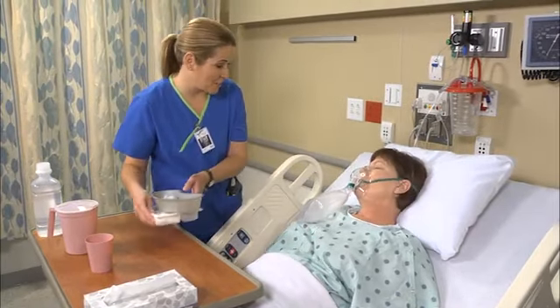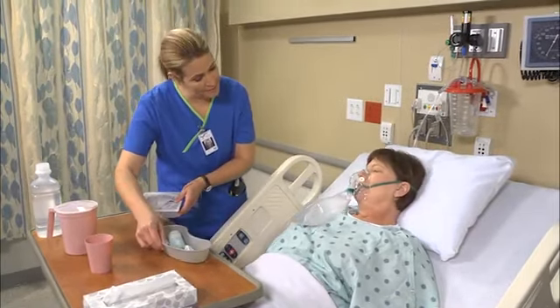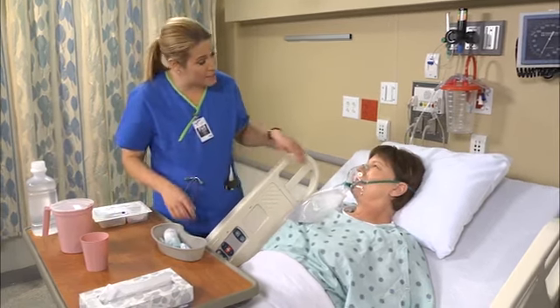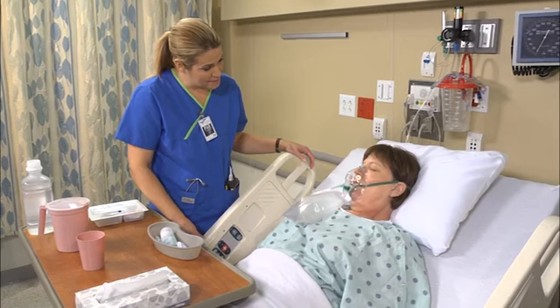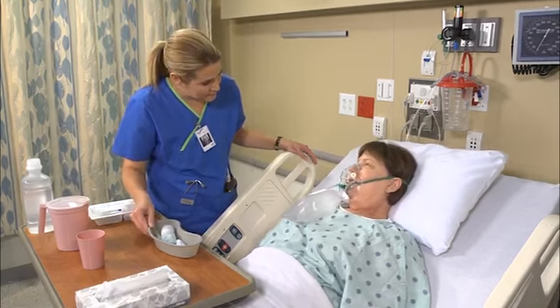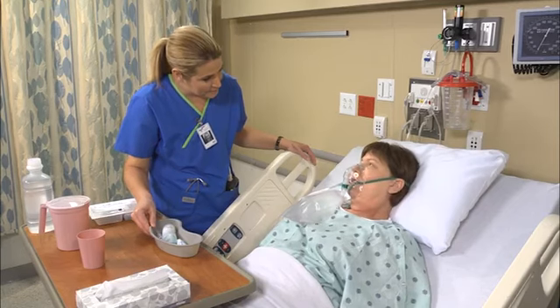Hi, Miss Kennedy. Are you doing okay? Do you feel better? You're breathing a little easier? Yeah. Place an unopened suction kit nearby for future use. Help the patient into a comfortable position and provide oral hygiene as needed.